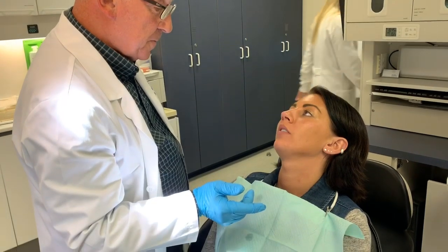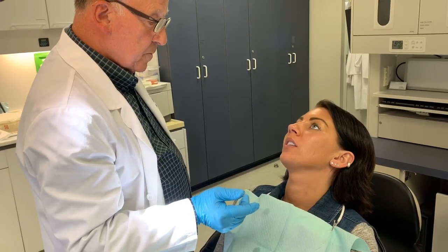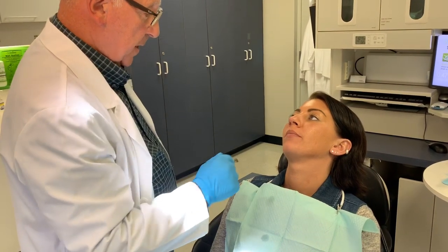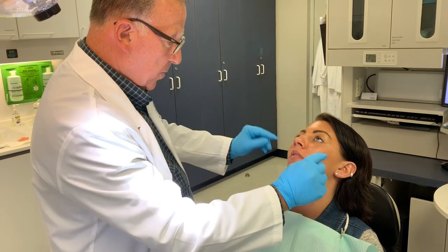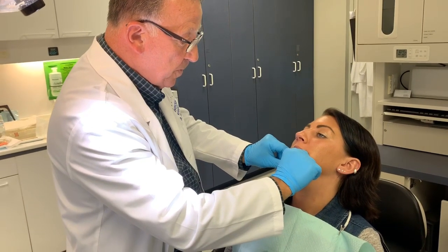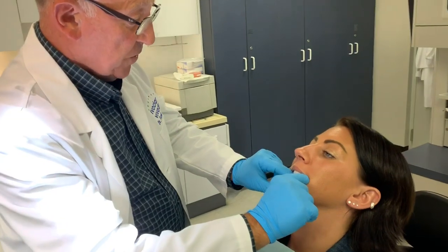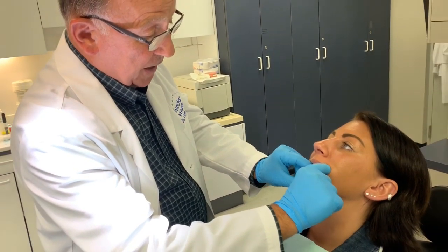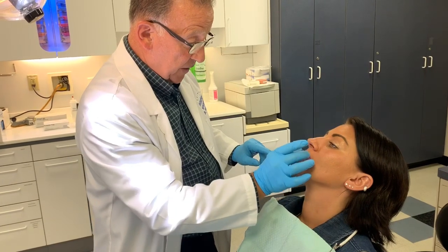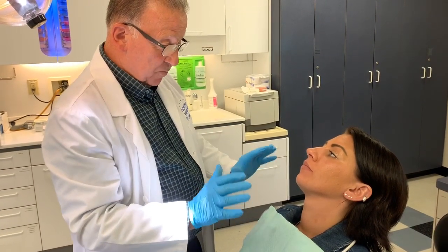Now count one to ten. One, two, three, four, five, six, seven, eight, nine, ten. Count faster — one, two, three, four, five, six, seven, eight, nine, ten. Open up a little, just relax your jaw, close real slow. The bite registration we took initially was a preliminary bite, but it's quite good — your teeth come together very, very nicely. I'm very happy with that.